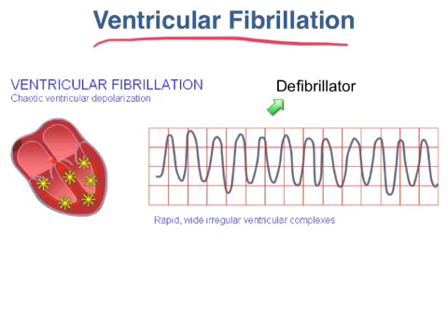If you've heard the term defibrillator, a defibrillator is an instrument that basically delivers an electrical shock to the heart. It momentarily depolarizes the heart muscle, in essence stopping the heart in order to get it out of this fibrillation pattern. Ideally, that brief depolarization of the entire heart muscle stops the fibrillation, and when the electric shock is removed, the SA node can take over again and reestablish a normal heartbeat.